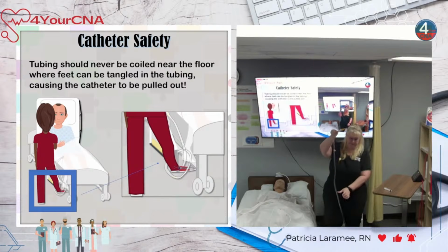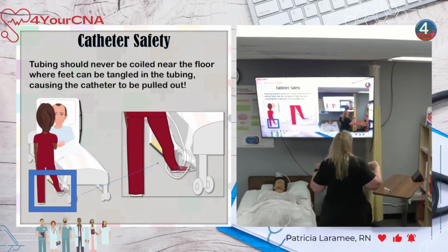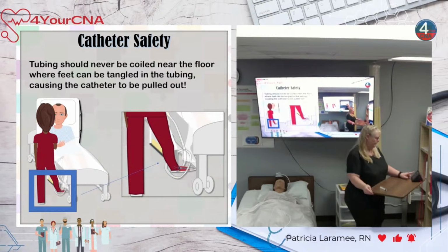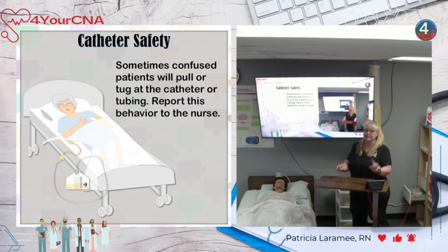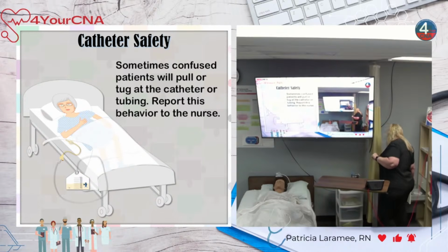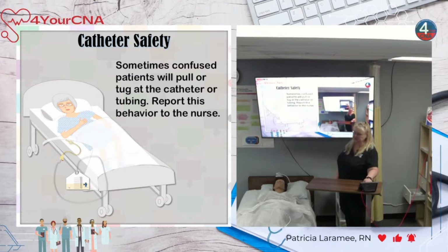Okay. So I'll pass that around so you can see how those go, you can try to pull it apart and put it back together. That's fine. Remember, you have to be trained to do that. Okay. This is not training for that. All right. So sometimes patients pull it out, let the nurse know.